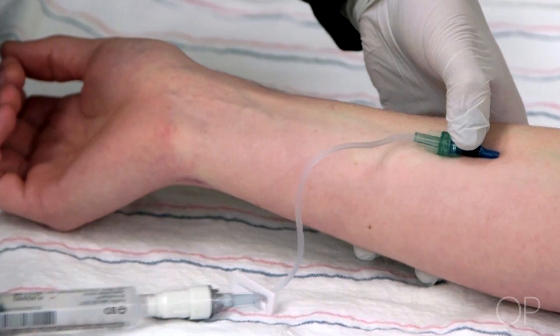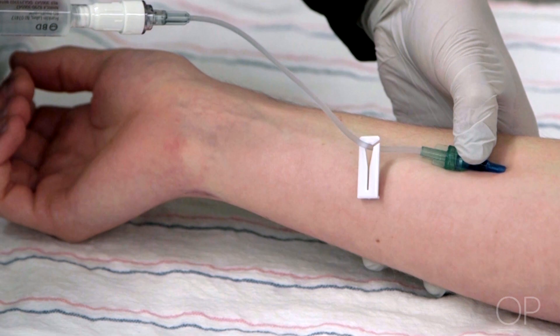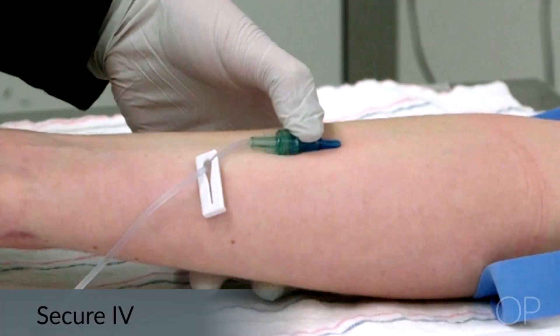Infiltration is caused when the catheter is no longer in the vein and fluid is now infusing into the patient's soft tissue. It can also occur when there is a hole in the vein that has gotten large enough to allow extra fluid to leak out around the insertion site and into the tissue.